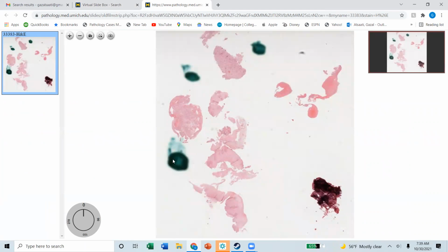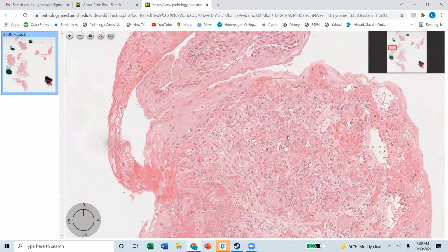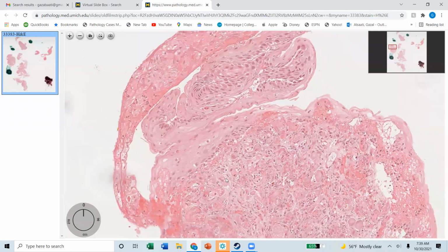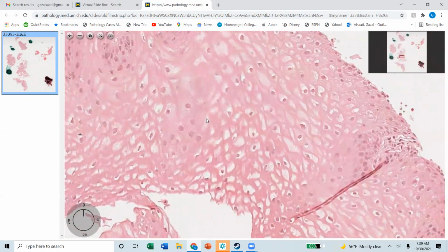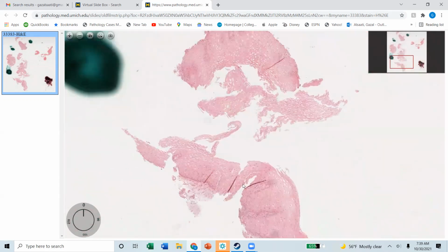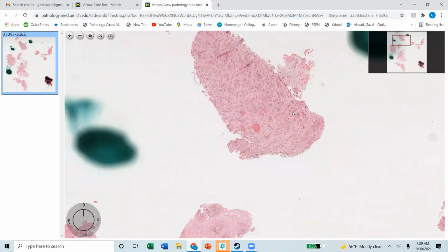All right, the dot sign. Okay, so first of all, I want to make sure that we're looking at an esophagus. But yes, we are. It's such inflamed granulation tissue. It's a weird esophageal biopsy. Oh, here you go. It's a very old slide, just to let you know that it's not as common to see CMV in the esophagus. But definitely you have an esophagus with an ulceration, erosion, and granulation tissue. Let me tell you how I went to that diagnosis.